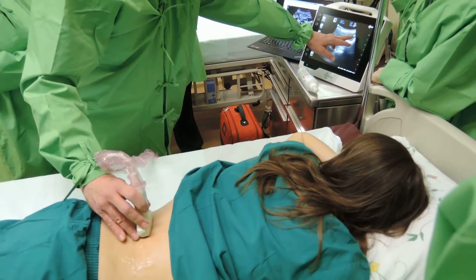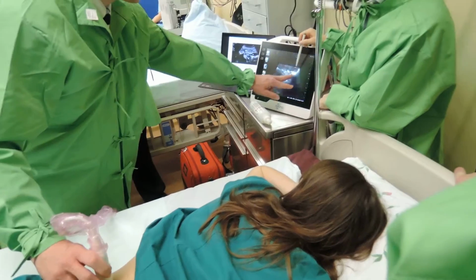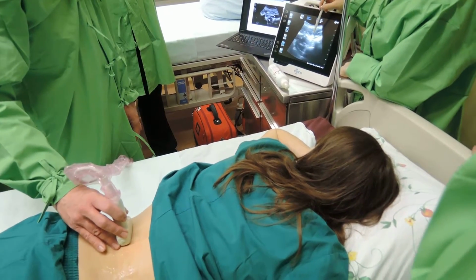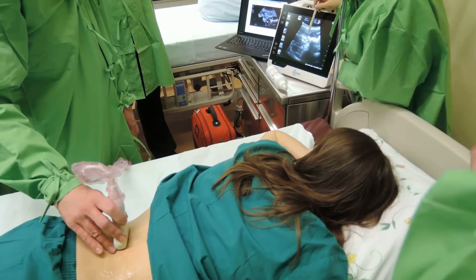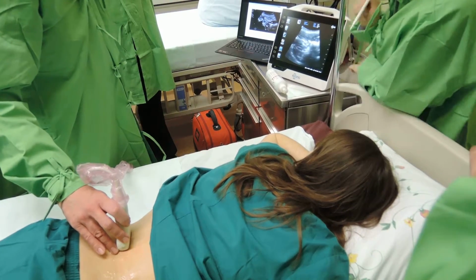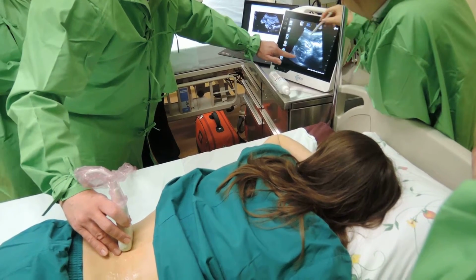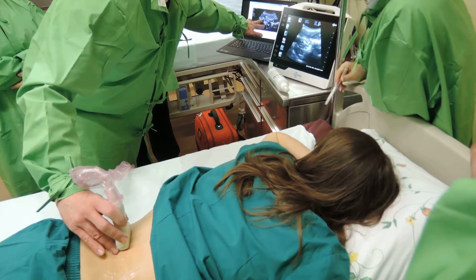A bit more lateral, moving away from the midline again, only now to the other side. So we have the spinous process, the articular joint with the lamina, and the vertebral body. This is the psoas muscle. There's the peritoneum. You see, this is the abdominal cavity already, because the girl is slim.